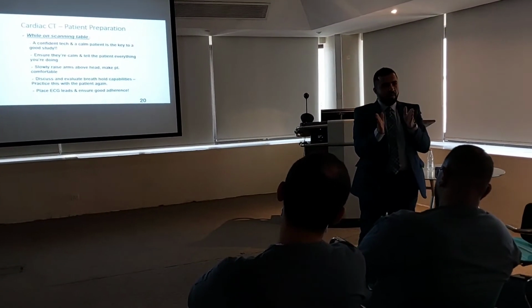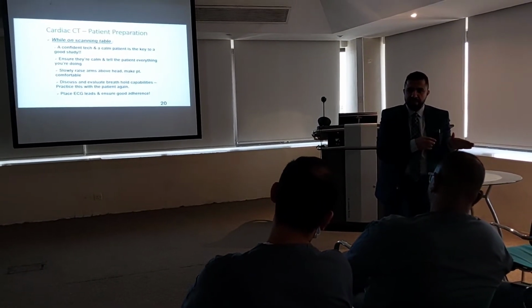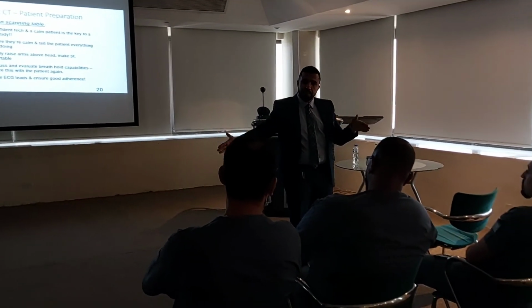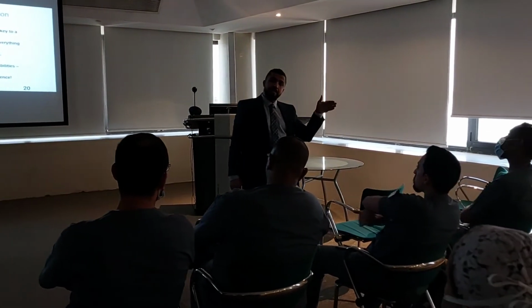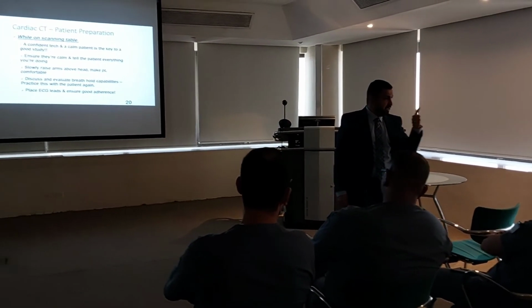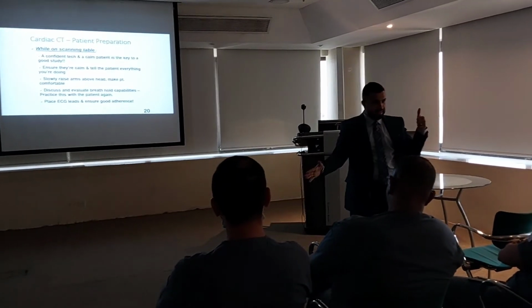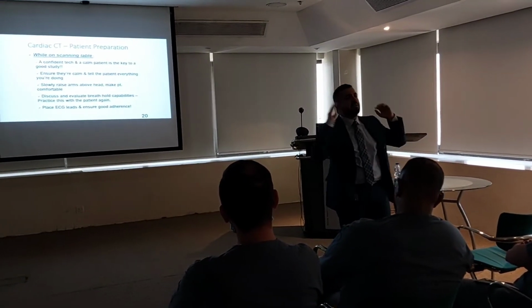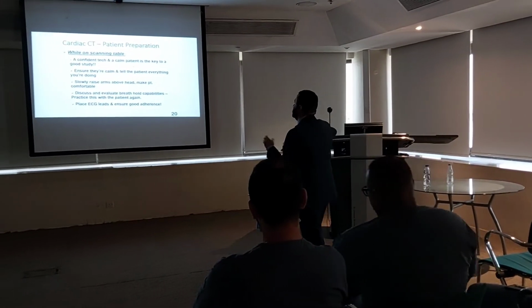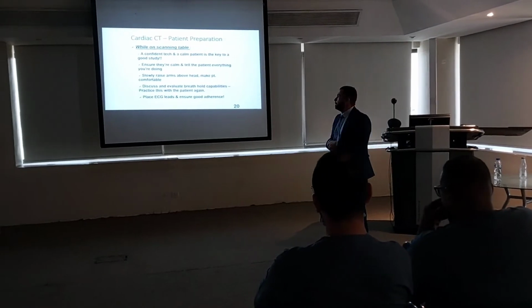Now it's a matter of seconds; definitely he can handle it even if it's painful. But if I keep him that way the whole time until I am in the main position, either he will start feeling more pain, which elevates the heart rate and compromises the scan, or he cannot handle it anymore. You get that? So it's that deep into details. Okay? Right.